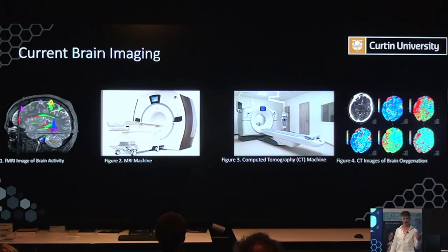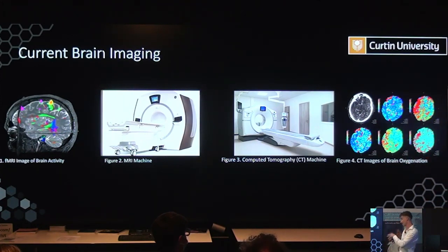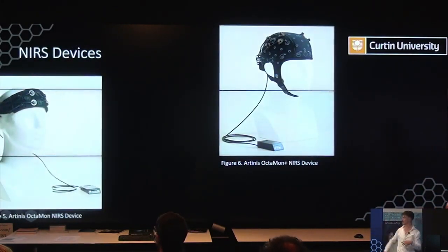Now, near-infrared spectroscopy, this is our device here. The devices are much smaller, more portable, and use much simpler technology, not to mention stylish on the forehead as well. But one thing I want to illustrate is how simple the technology that these use. So these are two examples of near-infrared devices. This is the one we've got, potentially for people online, and this is just a different model.